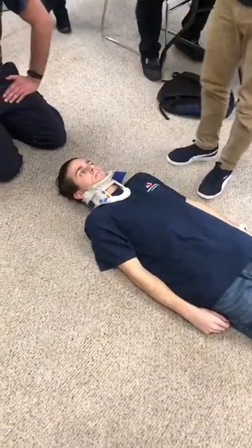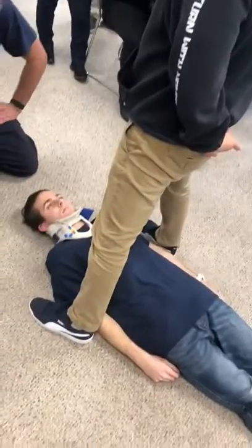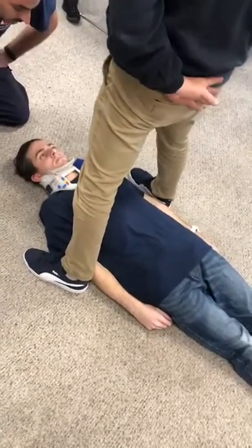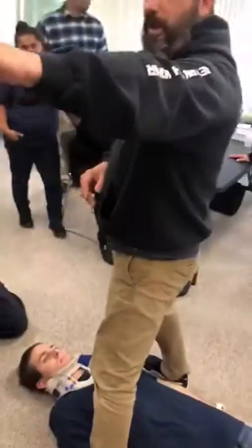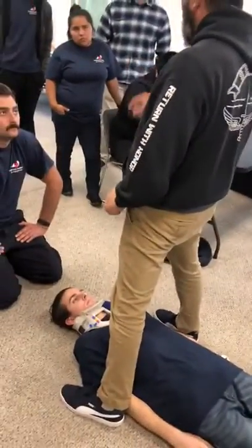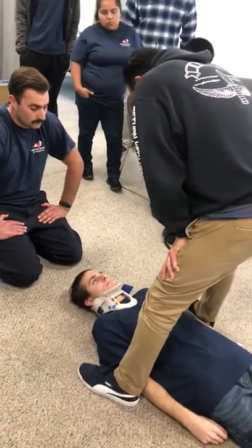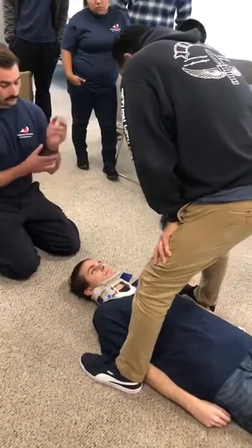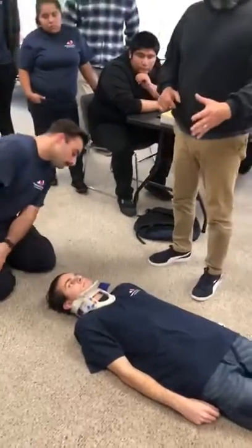An evaluator will be standing here watching you. He's going to ask: 'Are you done placing your collar?' You say yes or no. If you're done, he'll say step back, come over the top, and check that it's not deviated — it's midline and there are no infractions. If he says good to go, you continue on with the scenario.